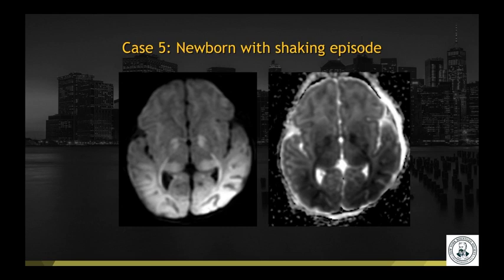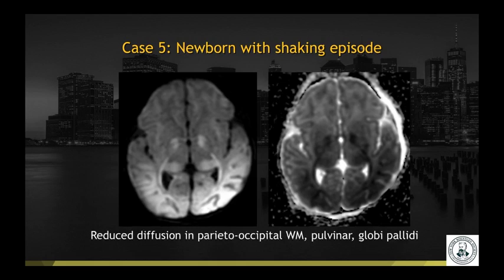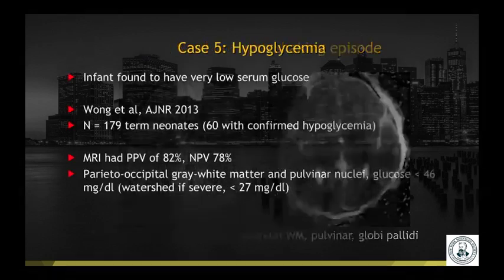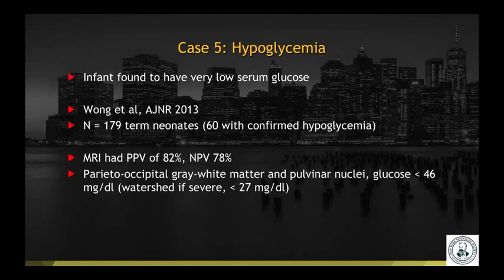Case number five: a newborn with a shaking episode. Diffusion and ADC map demonstrate reduced diffusion in the parietal and occipital white matter, the pulvinar nuclei of the thalami, as well as the globi pallidi. This was a case of hypoglycemia; the infant was found to have a very low serum glucose. A large cohort study published in AJNR demonstrated that this distribution — involving the parietal and occipital lobes as well as the pulvinar nuclei — had a positive predictive value of 82% and a negative predictive value of 78%.